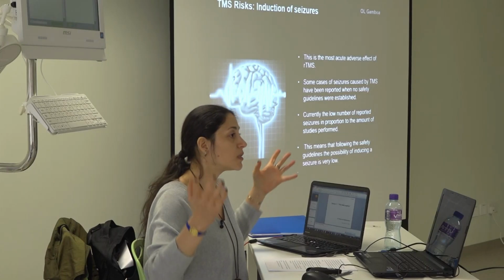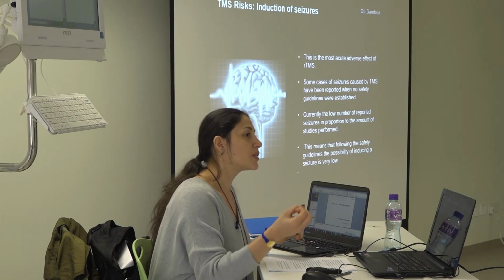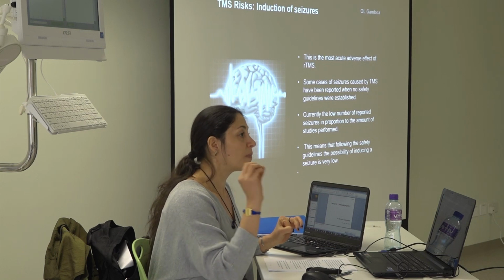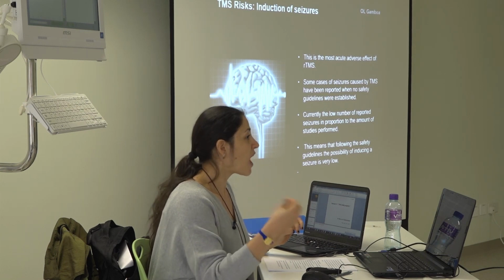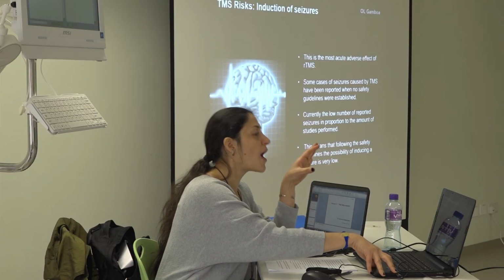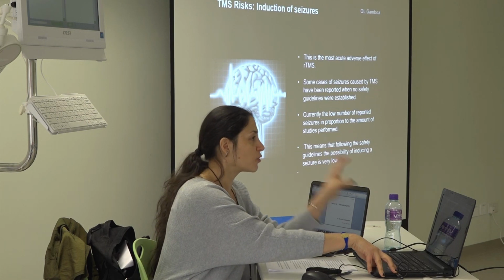And the number of seizures reported in the research is actually very low compared to the amount of research being done, including patients. They have even been studying people with epilepsy, and they haven't caused seizures. There is a type of epilepsy that is very reactive, and then you could cause a seizure. But in these cases, you will work with a neurologist or an epileptologist, right? You will not be doing research. That is a no-go.